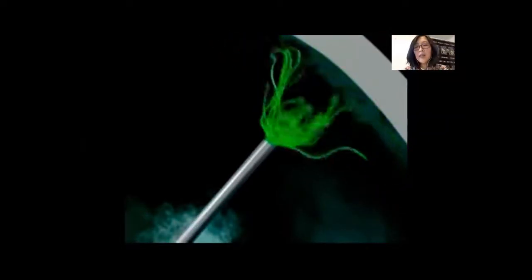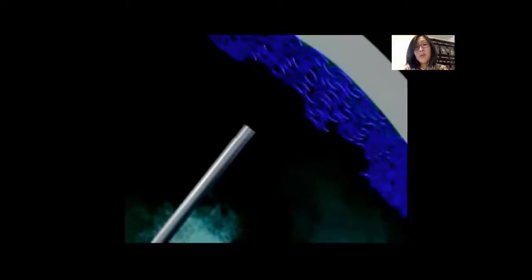And this is a video that shows why this is important. It also is important when we remove them from the eye. So this is a cohesive viscoelastic. You can see once you grab part of it and you aspirate, it's going to come up as a single long chain versus your dispersive. You can see here, when we take these out, these are going to come out individually. And the importance of this is that dispersives need to be removed in their entirety, because if you have viscoelastic that remains, this is the source of your intraocular pressure spike post-op day 1. And so these need to be removed carefully.